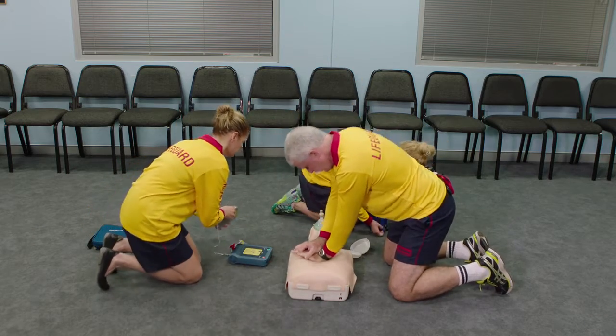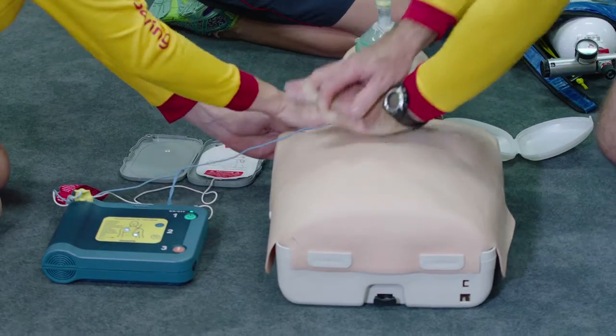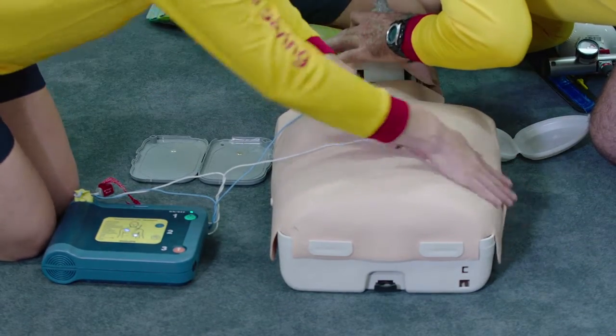Remove clothes from the patient's chest. Peel white pads from the grey plastic case. Attach pads to bare skin exactly as shown.